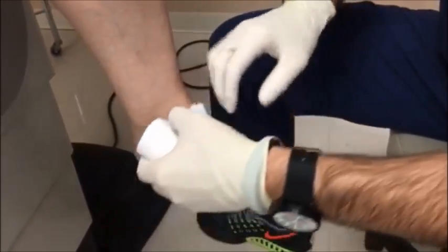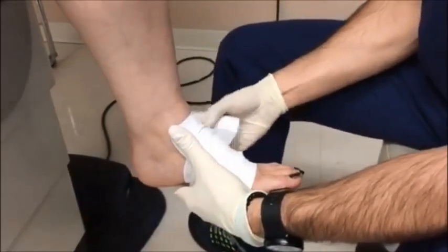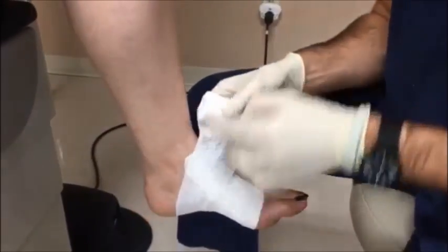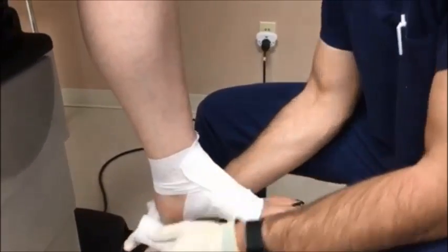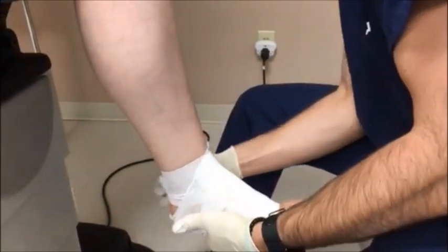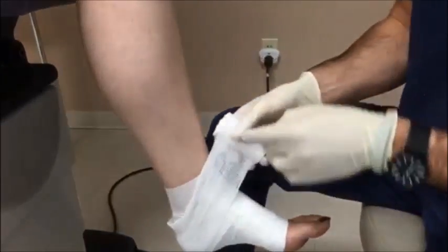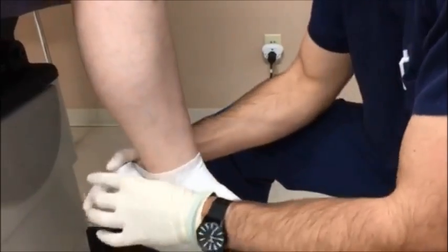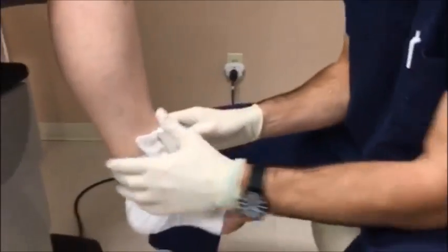And the reason we do that is so that if there is a lot of swelling, it allows the patient's foot and leg to swell while still providing compression but not cutting off the circulation. Okay, and then once you get to the heel, you go around the bottom of it without doing the overlapping to get it covered. And then you work your way up the leg just like you would any other wrap, going back and forth, half over each time.